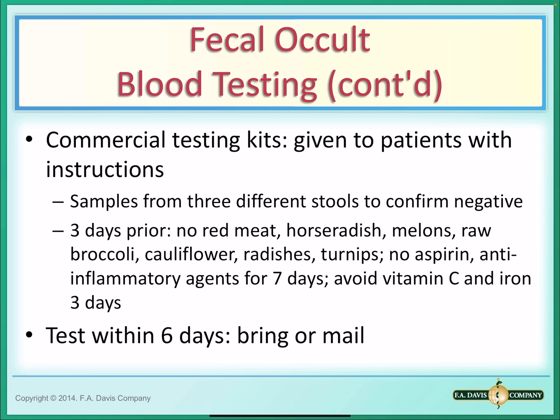When you obtain a sample from the center of the stool, that helps avoid false positive reactions from external contamination. The patient, right before we do this test, is asked to collect samples from stool specimens collected on 3 consecutive days. The sample is placed on the front side of the slide with an applicator stick, and the slide is closed. Adding hydrogen peroxide to the back of the filter slide that contains the stool produces a blue color with guaiac reagent when pseudoperoxidase activity is present.